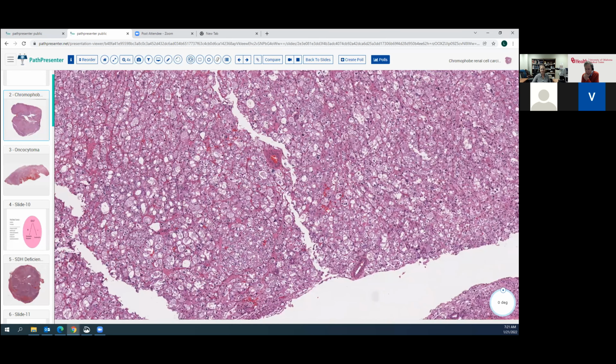Having a hard time saying leiomyomatosis this morning. There it goes. Hereditary leiomyomatosis. It's an autosomal dominant condition. It's due to a germline mutation in fumarate hydratase. These patients are usually young. If they're women, they'll have a history of uterine fibroids. Men will have maybe some cutaneous related smooth muscle neoplasms. They've got very prominent cherry red nucleoli with perinuclear halos. They can closely resemble melanoma or CMV or type 2 papillary RCC.